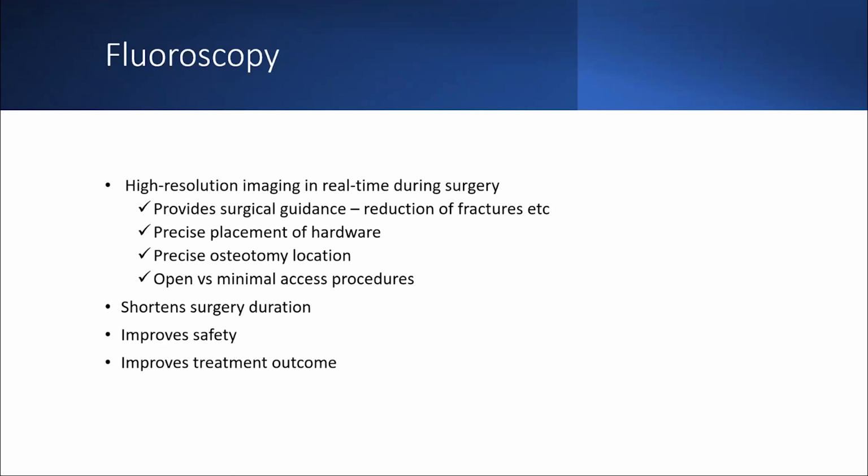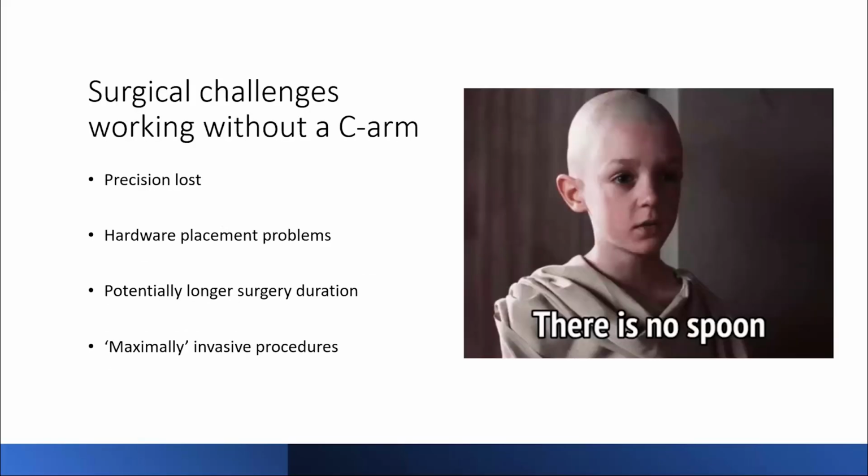It also allows you to do major surgery from a minimal access perspective rather than open surgery. Of course, the consequence of this is that the duration of surgery is reduced, and there is improvement in safety and overall treatment outcome.